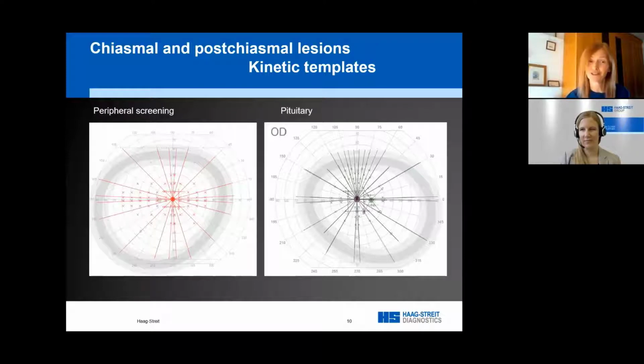However, if a patient gives up during a static test, then the same isn't the case, and we more often than not lose the data that has been collected so far. So the templates work well for us in both a screening assessment and also in a diagnostic situation, where we can capture a fair amount of information, but if we can't continue the test, we've not lost everything.